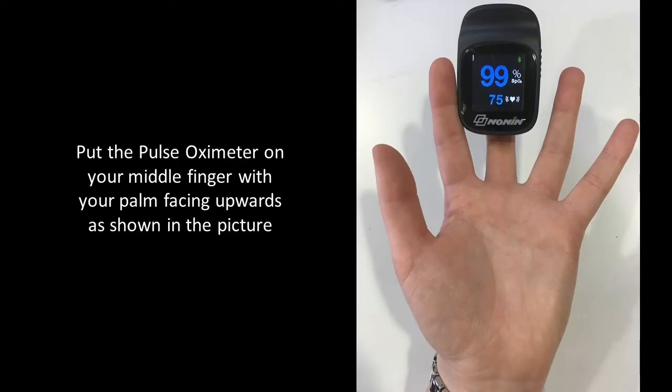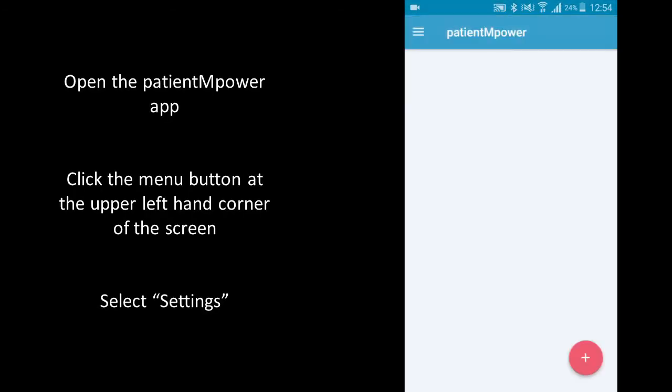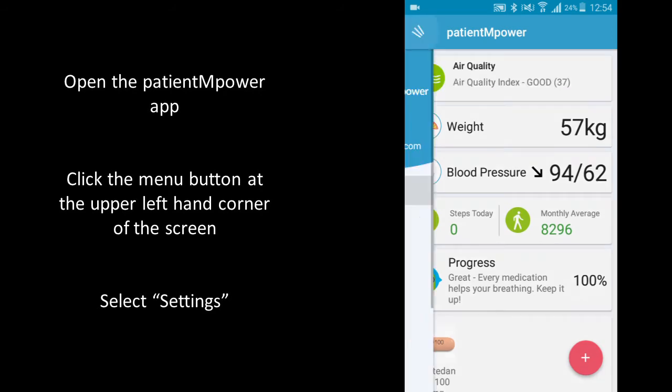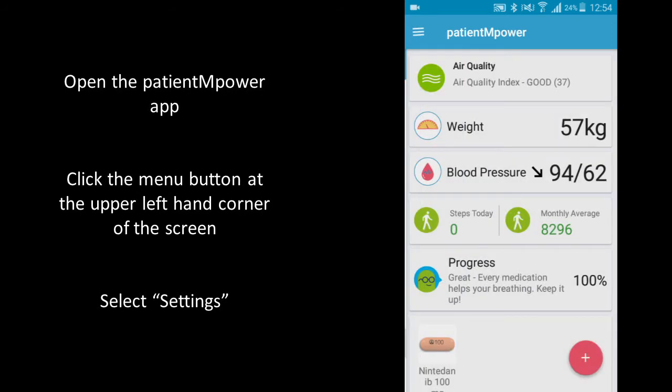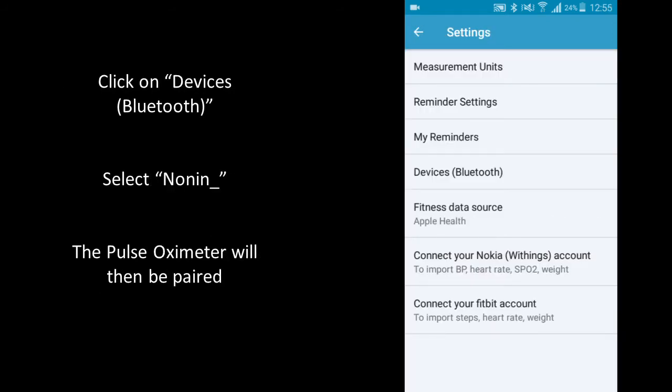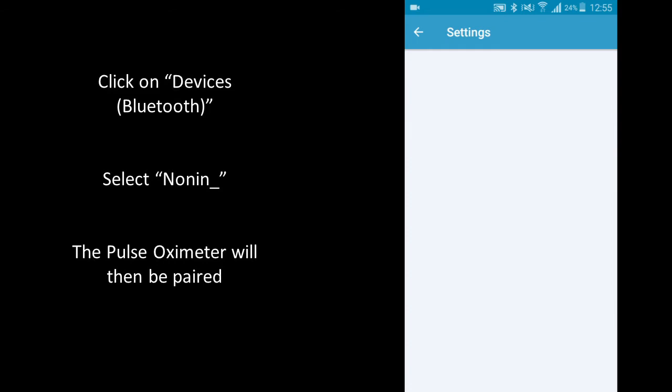Put the Nonin Pulse Oximeter on your finger with your palm facing upwards as shown in the picture. Open the Patient Empower app and click the menu button at the upper left hand corner of the screen. Select settings and then click devices Bluetooth.